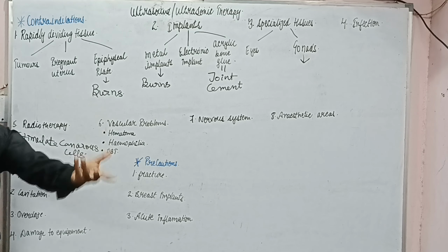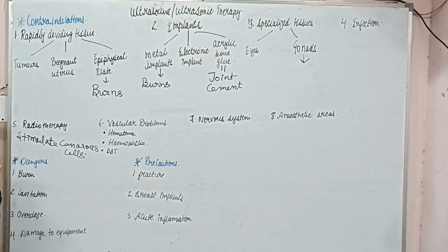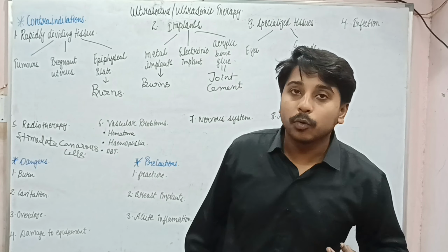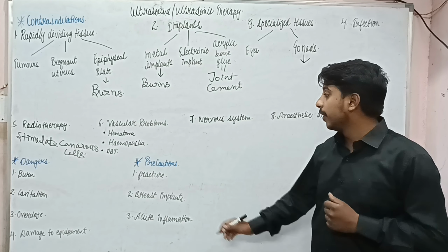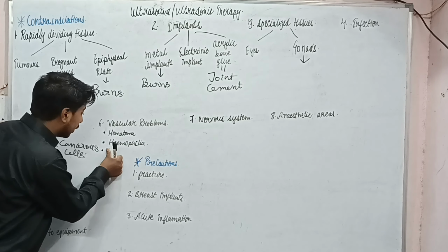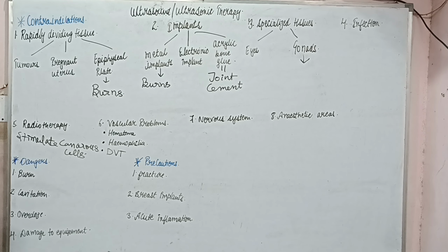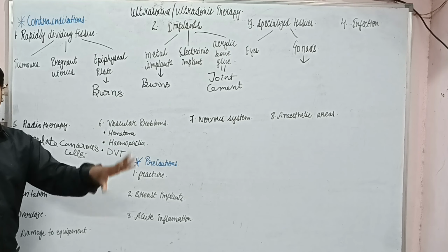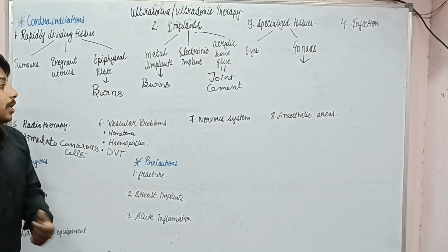Next is vascular problems. In case any kind of bleeding is suspected, we will not apply ultrasound. Why? Because it is a heating modality and it can definitely increase the bleeding. Whereas in case of DVT, deep vein thrombosis, it can lead to rupture of the thrombus and lead to the formation of an embolism, which is more dangerous.